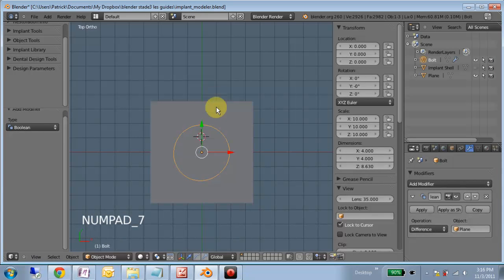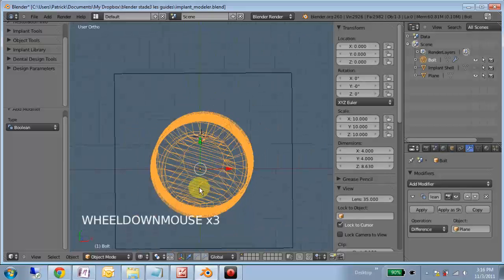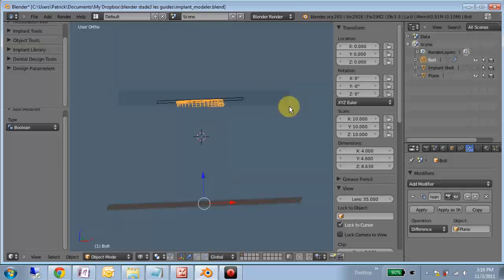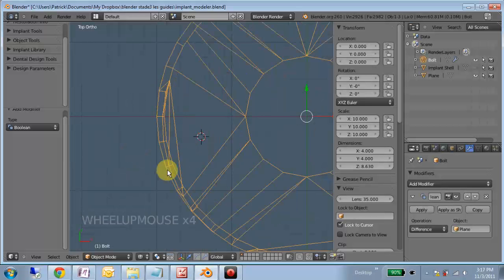Now if we look at this from above and we switch to a wireframe mode, this is going to be a little difficult to visualize. Okay, so we see that the whole point of having this circular thing is if we didn't have it, these lines would all crisscross across the implant. And just like I showed you before, we're going to want access easily to that outer ring. So my goal is to be able to select just this inner ring and then delete it, have access to the ring. But you see that we've got these crossing pieces here.